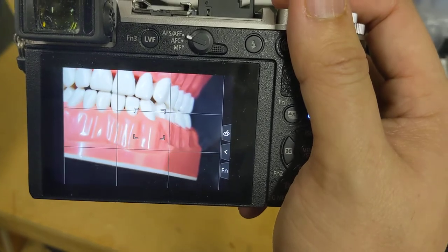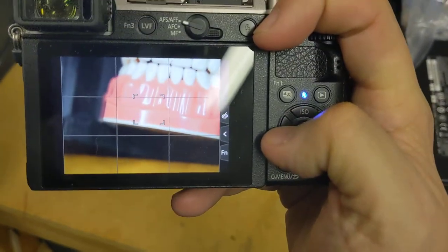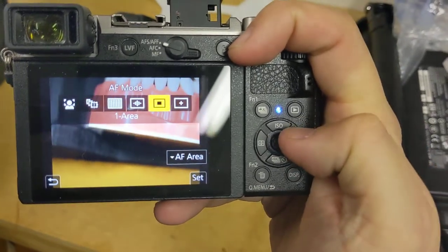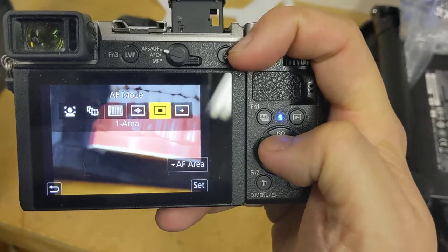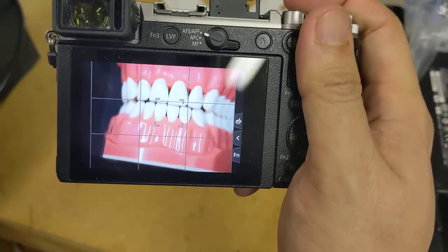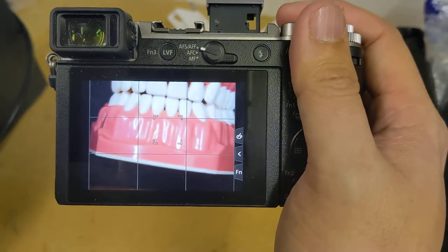First tip: make sure you have a bracket right in the center of the picture. If you don't see a bracket, you're probably on auto. Push this button, change the AF mode to the one-area focus mode, and make sure you touch the screen right in the middle so it's focusing in the center of the screen, not off on some corner if you touch the screen inadvertently.